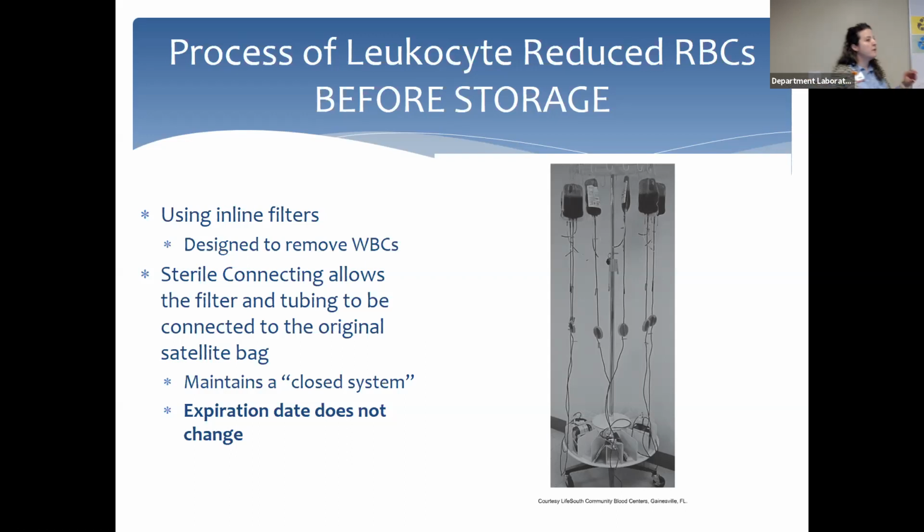All right, so remember I talked about sometimes when we alter the unit, it changes the expiration date. Because leukoreduction is done in a closed system, this filter in the extra bag is attached to your mother unit using a sterile docking station. So it is still considered a closed system. Your expiration date has not changed, all right?